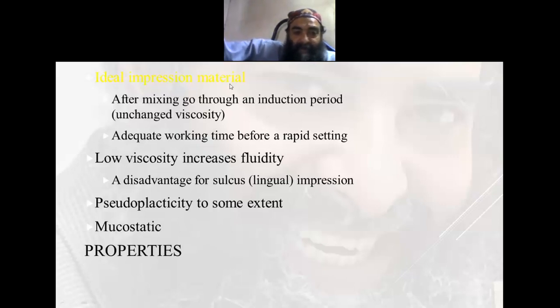But it is a disadvantage for the lingual sulcus impression, especially the lingual sulcus, because it flows away and the impression is not obtained at the lingual sulcular level.